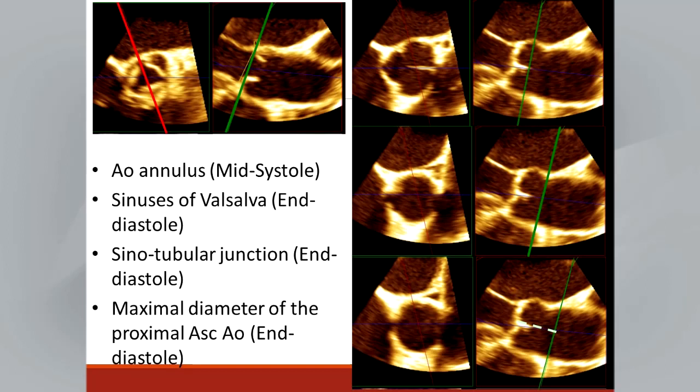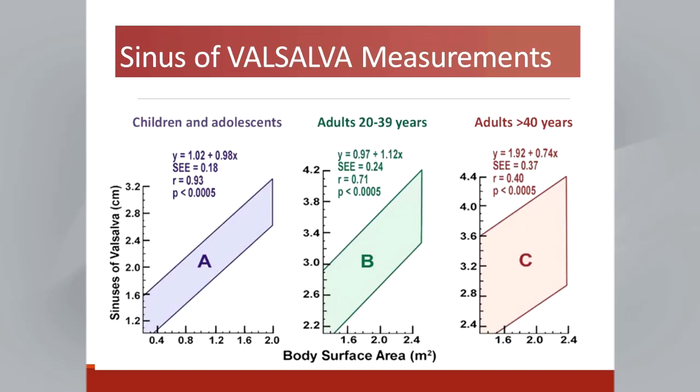If we change to inner, then these normative values, at which we should do something in the aortic root, at 4.5 or 5, would have to be changed. And I know that this is going to be very controversial. When we do the measurements of sinuses of Valsalva, these are measurements that usually have an impact on the dissection of the aorta and also on aortic valve regurgitation.